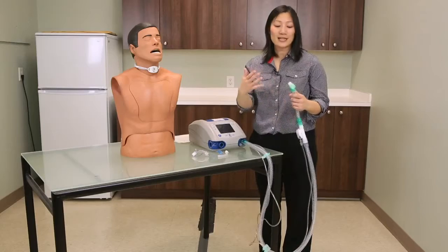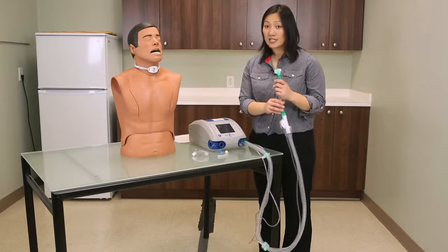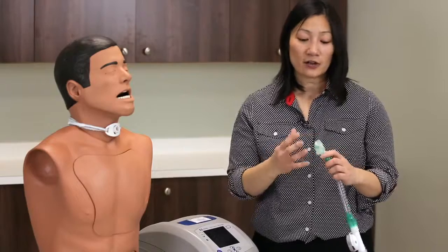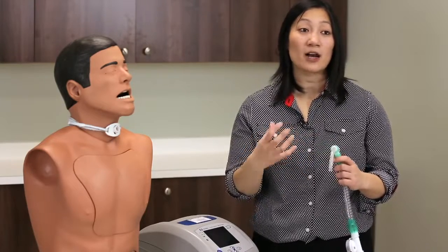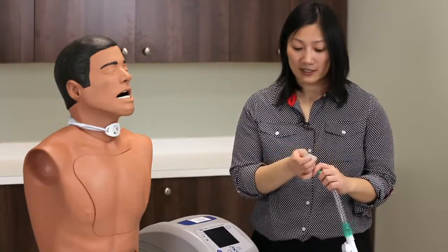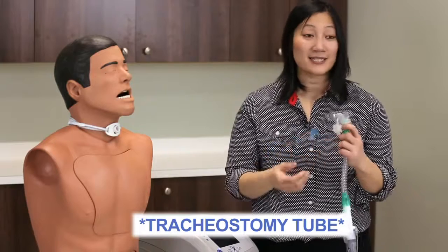To appropriately set your low pressure alarm on your ventilator, you take your ventilator circuit and attach it to your inner cannula. Your inner cannula is the most narrow part of the circuit. If you don't have a tracheostomy that has an inner cannula, you can attach the actual tracheostomy instead.